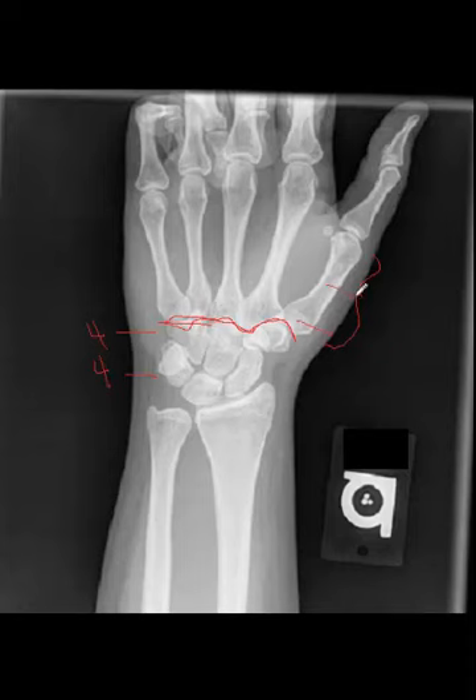Metacarpals have bases, shafts, and heads. The metacarpal bases articulate with the carpals, making the carpal metacarpal joints. We only see the proximal phalanxes, really just the base. The joint space between the metacarpal and the phalange is called the metacarpal phalangeal joint — this is where fingers are commonly dislocated. The triangular fibrocartilage of the wrist is not normally seen radiographically, but can undergo calcification and may be seen in that region.